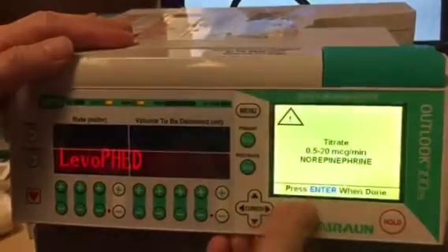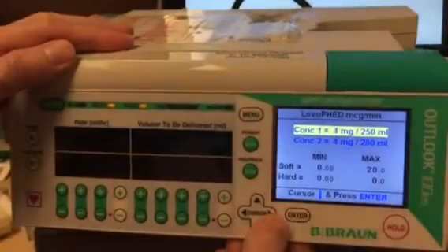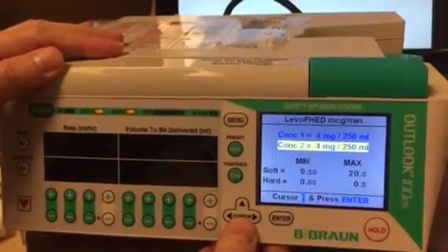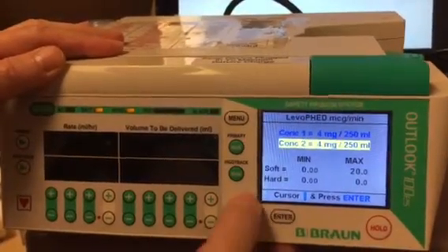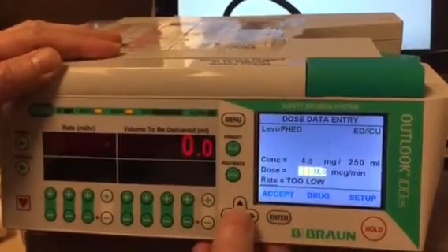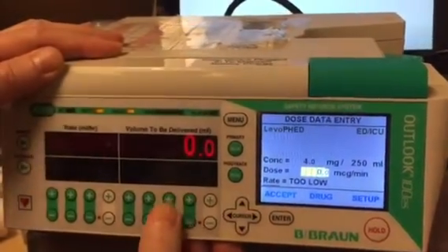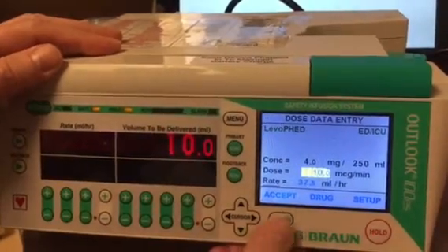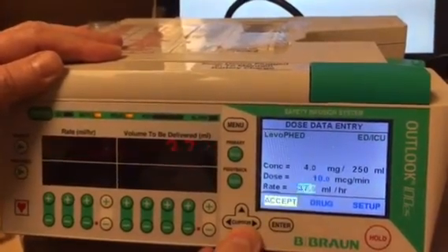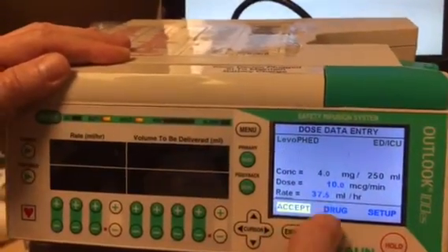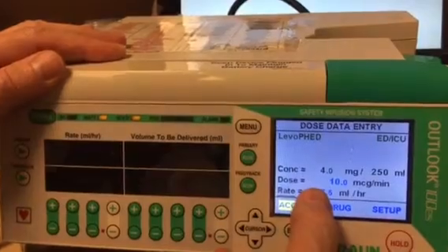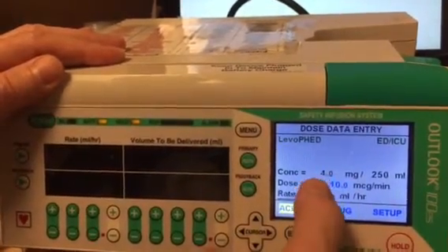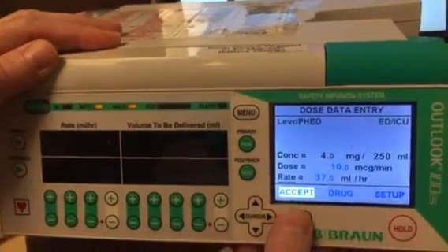We're doing the Levophed drip. Let's say the doctor orders it at 10 mics per minute to start. You've got that running, and it's at 37.5 mLs an hour, going at 10 mics per minute.